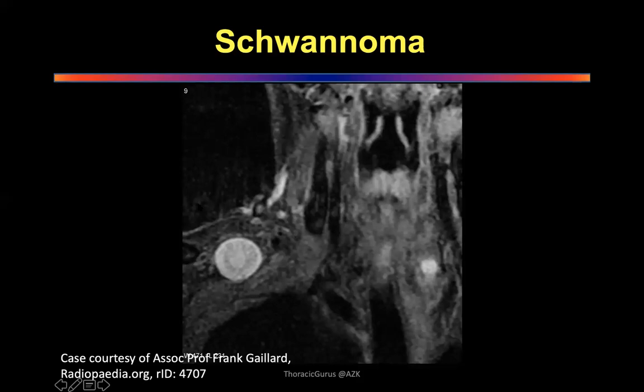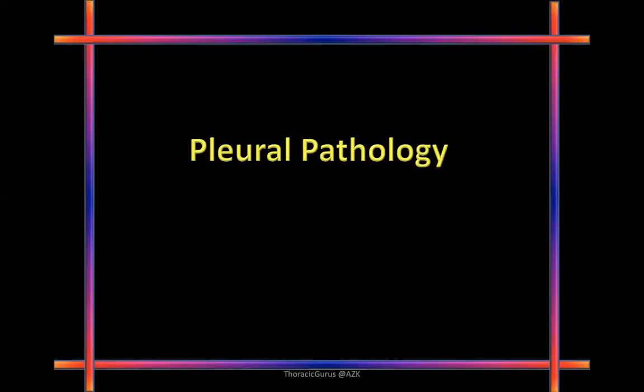Bhushan, take it. Good. This is an MRI T2-weighted image with a well-defined homogeneous mass lesion located in the supraclavicular or thoracic inlet region. Because it's in close proximity to the brachial plexus. Good. Want to see the involvement of the brachial plexus. Diagnosis is a neurogenic tumor. Okay. I won't go through this now.